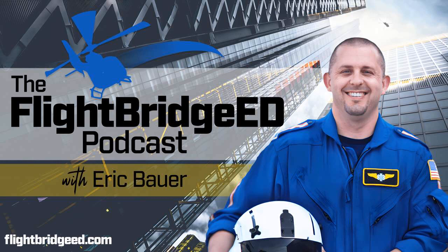They forget to use this tool, and they'll adjust their respiratory rate to affect changes in their CO2, and they totally forget about the I:E ratio. And remember, we want to maintain a good minute ventilation. That's essential. If you start messing with the tidal volume or the respiratory rate, you're going to affect that. So I:E ratio is going to be a big thing in these patients.